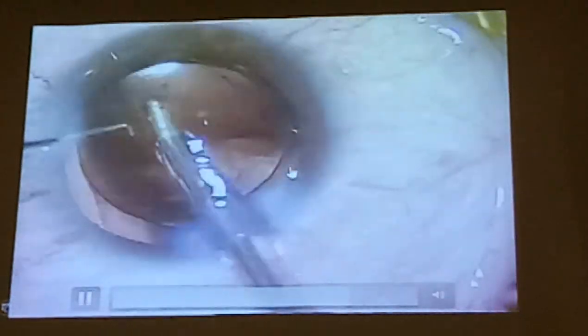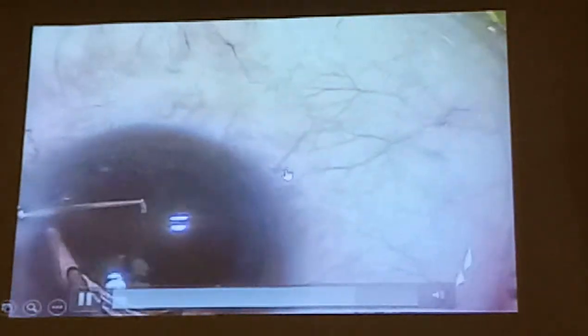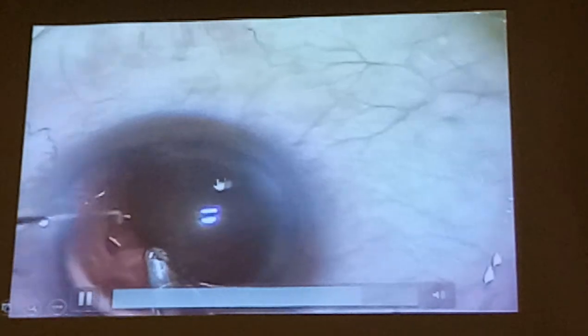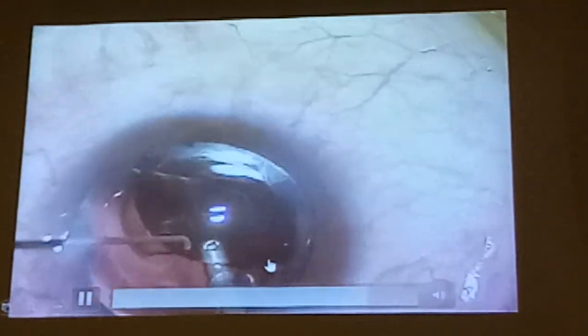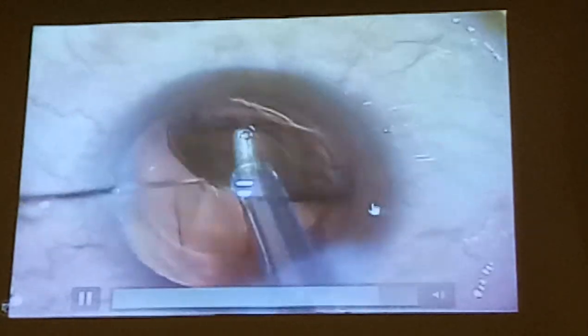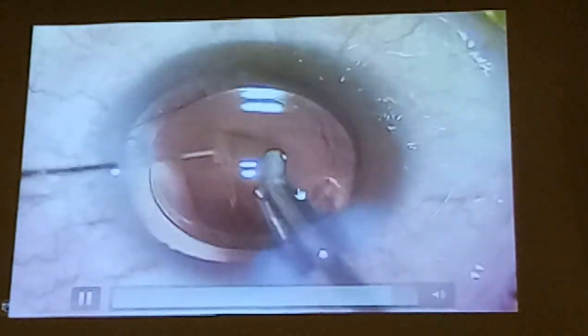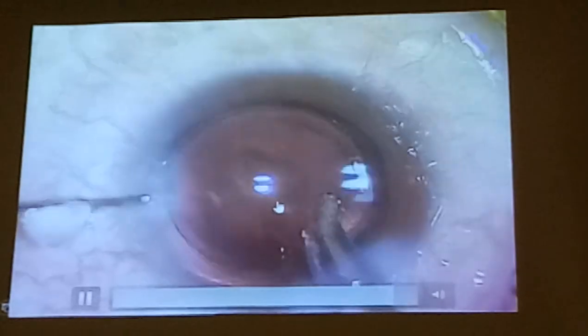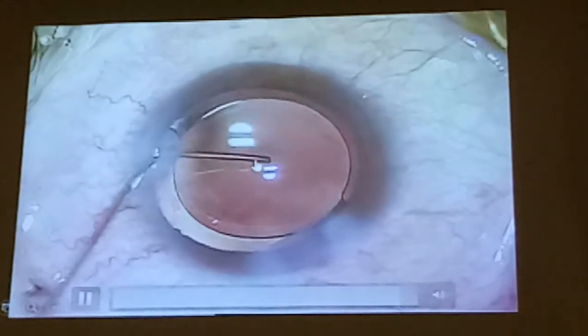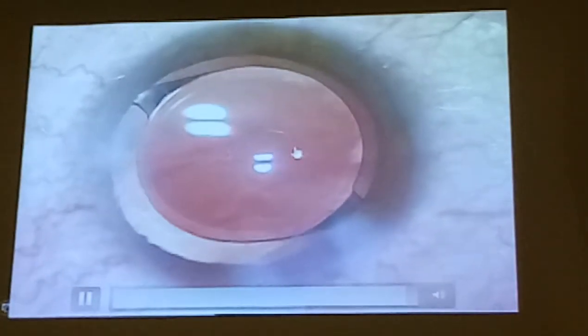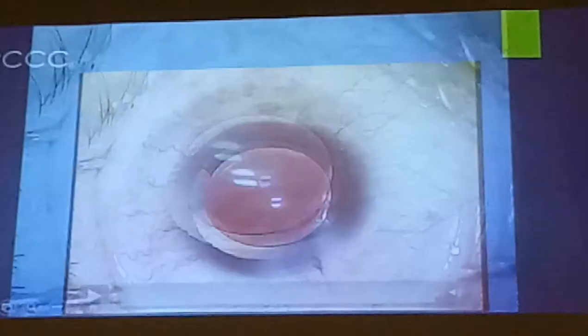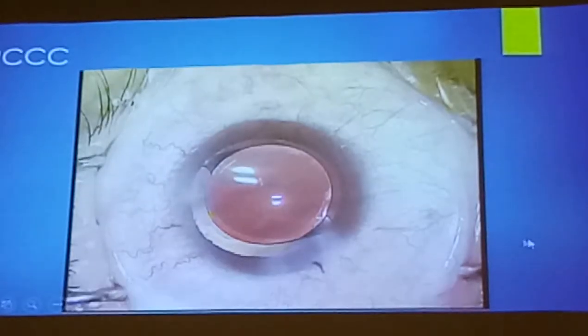So I'm just going to round this up — you catch the leading edge and do a little smooth-over, and then you have a nice round hole. That's the posterior polar defect with a strand of vitreous attached to it. In such cases, because you have done a PCCC — posterior continuous curvilinear capsulorhexis — you can still even remove the cortex from underneath. It doesn't extend. You manipulate, do whatever you need to. Very safely. Just don't dip your I/A tip into that hole. And you see it just does not extend. The patient will do well.